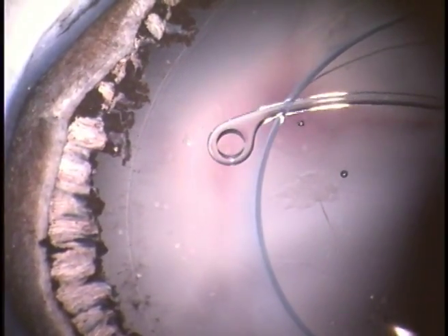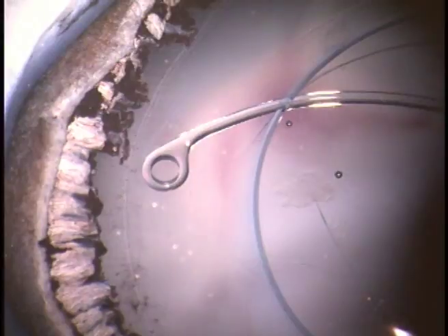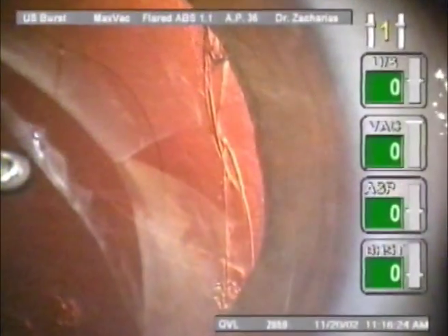After the initial contact between the capsular ring and the peripheral capsule, the ring is forced to slide circularly following the inner equatorial wall of the lens capsule. Capsular folds from a loose zonule may promote entrapment of the ring and the extension of zonular damage during insertion.